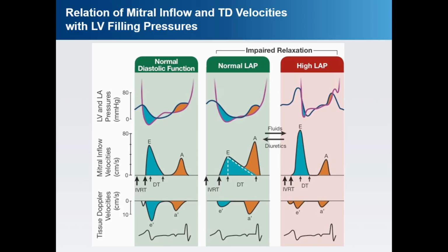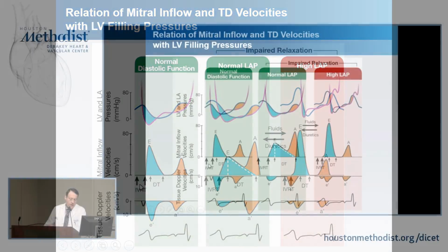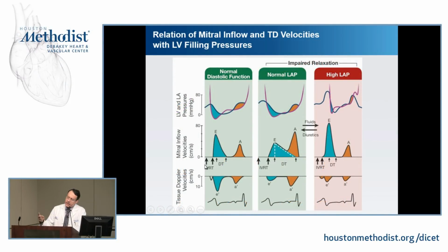If you go back to the auscultation skills, this time interval, we get to pay attention to it, for example, in patients with mitral stenosis. The time interval gets shorter as the left atrial pressure goes up in more severe stenosis. So the concept of the IVRT is not unique to echocardiography. What I want to say, it has been reported with phonocardiography before.